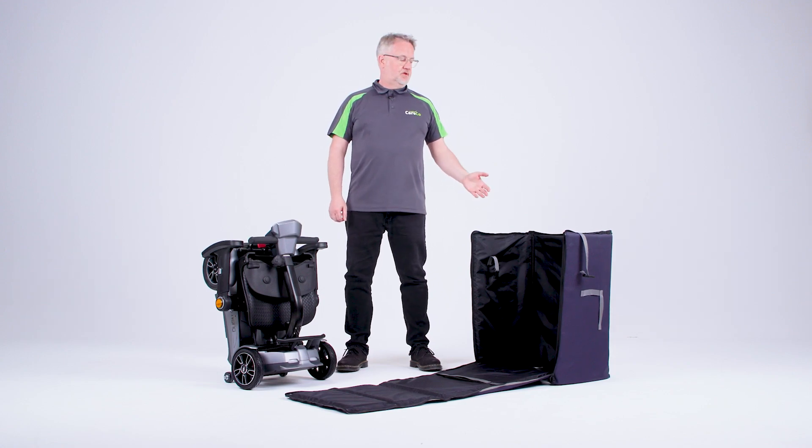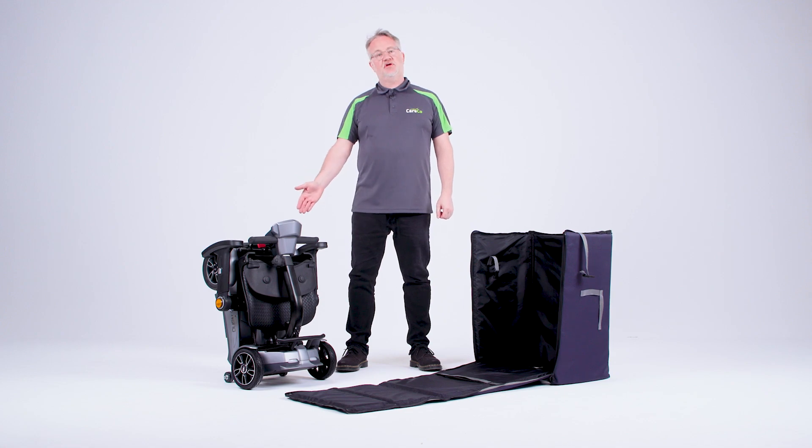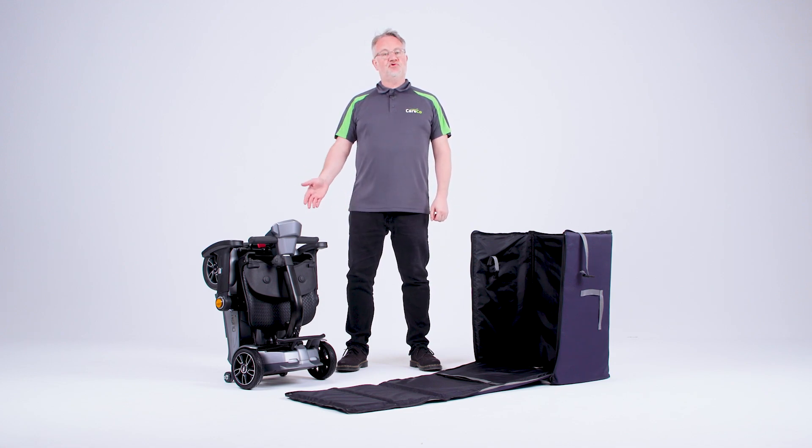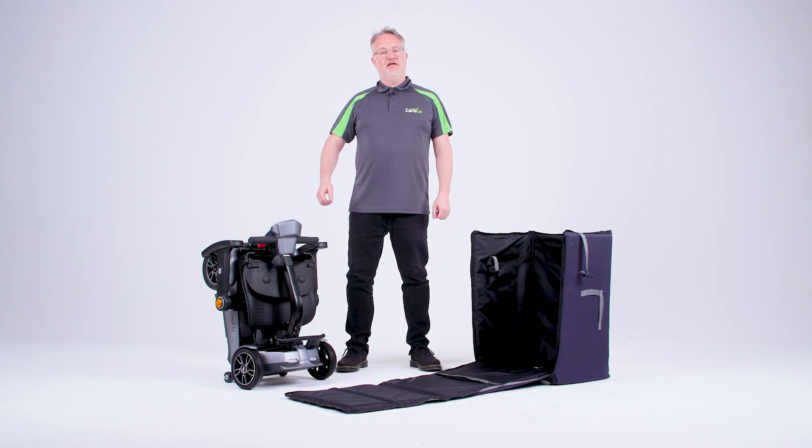Hello, I'm Simon from Careco. Here we have the X-Go Nano travel bag for use with the X-Go Nano. It can be used to transport your mobility scooter in the car or on holiday.